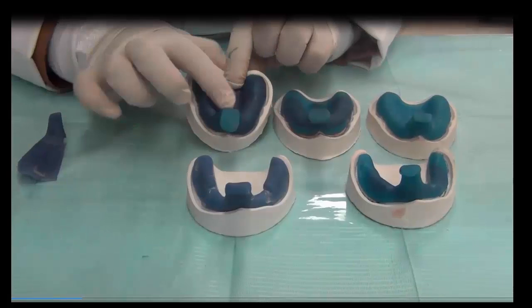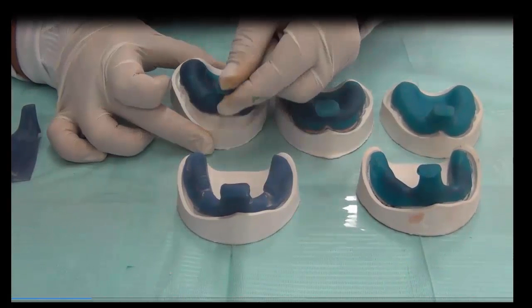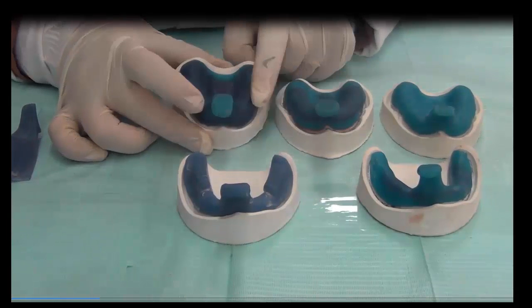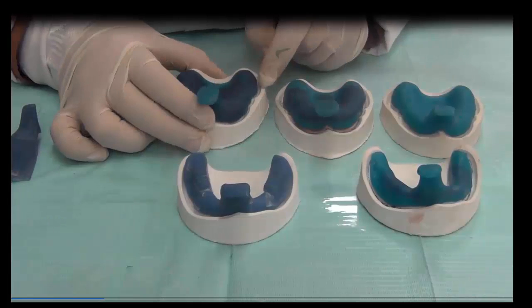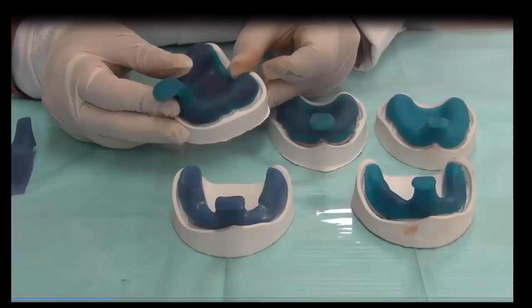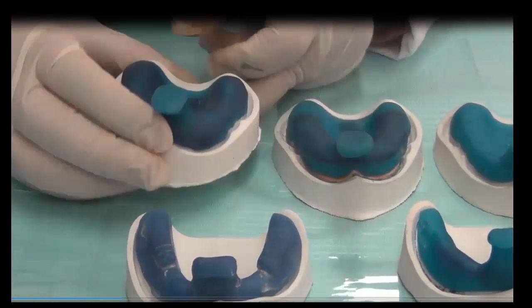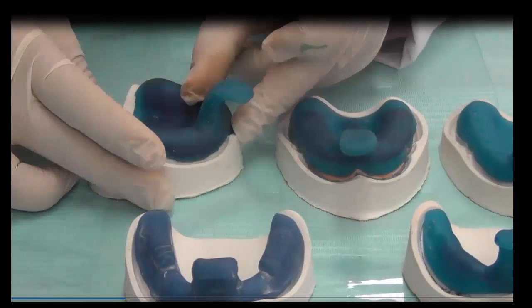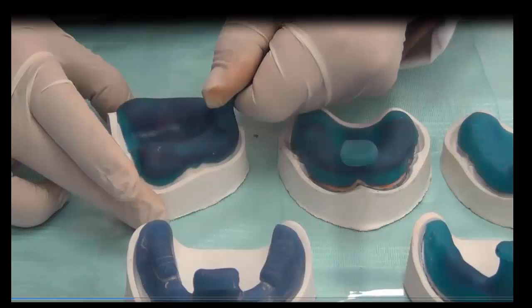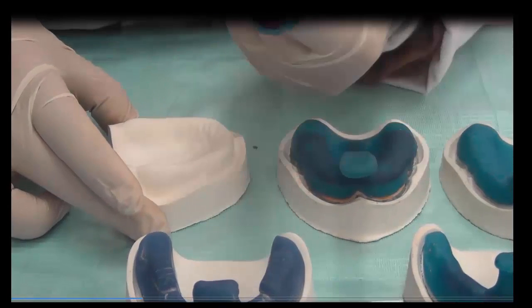The body of the tray extends over the what we call basal seat area, and these are the areas that will be covered by the denture later on. So the body goes all the way towards the sulcus, but not totally inside the sulcus, but 2 millimeters away from the border. The handle provides the grip to hold the tray while I'm taking the impression inside the patient's mouth later on. So I need to hold the tray securely in my finger.